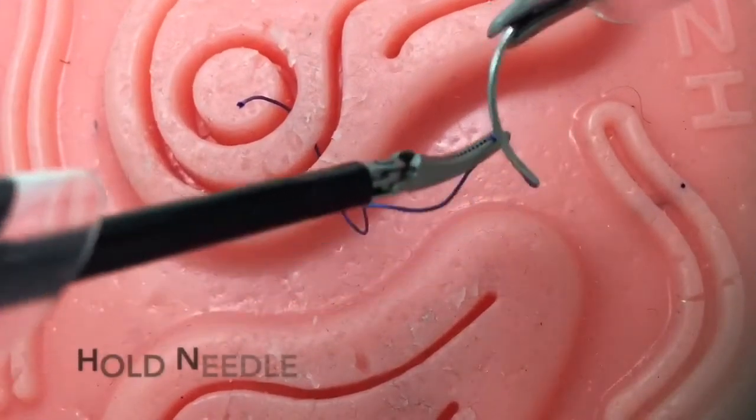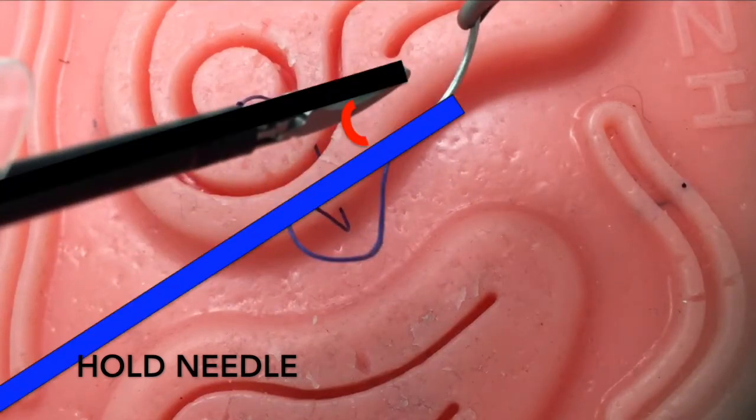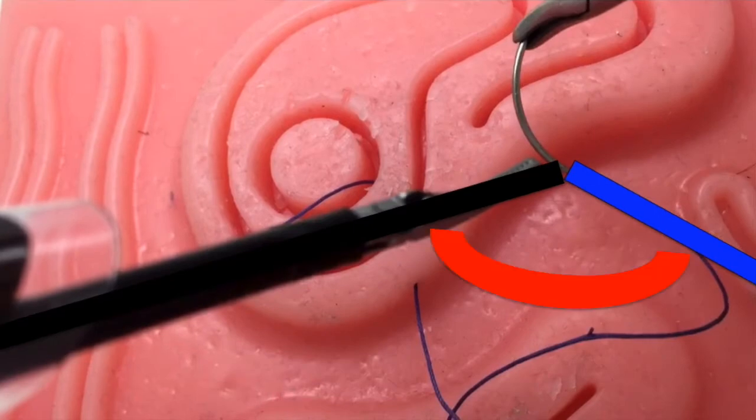For the hold needle technique, always remember to rotate the needle to line up with the suture, and orientate it such that the instrument-to-suture angle is minimized. As shown, a large instrument-to-suture angle makes throwing a knot very challenging.